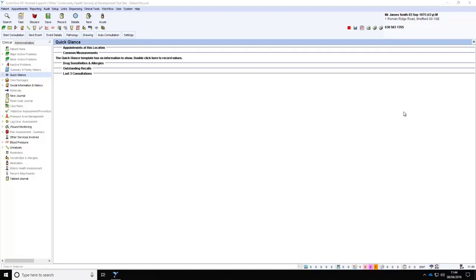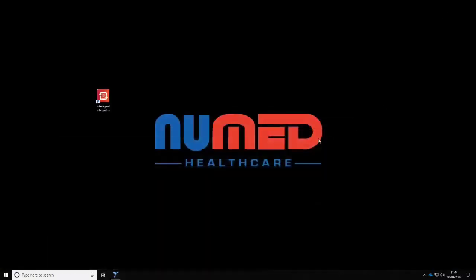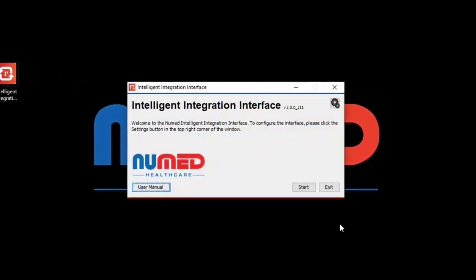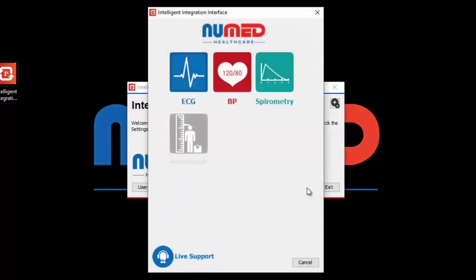Click the i3 icon on the taskbar. This will launch the i3 software whilst keeping System 1 in the background. If you don't have the i3 icon on the taskbar, then you will find this on the desktop. Clicking the start button will take you to the product selection screen. Click the ECG button. If you are using more than one type of ECG machine, a submenu will appear. Ensure that MAC PDF filer is selected, then click Start.